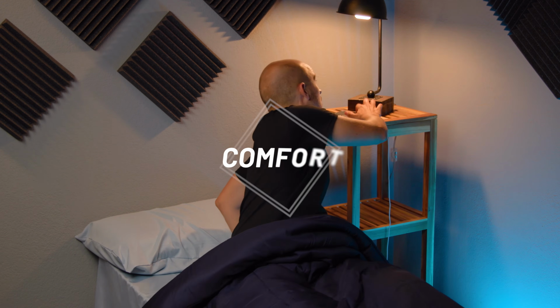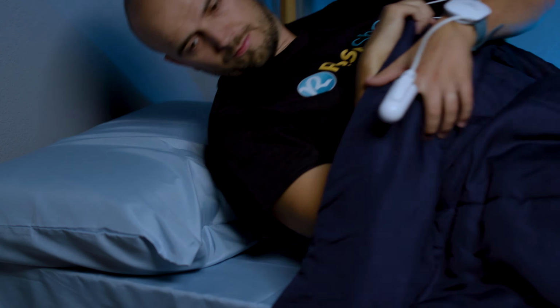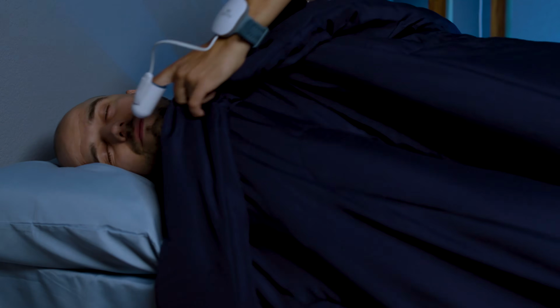For comfort, however, well, you just can't beat sleeping in your own bed, so an at-home sleep test wins here hands down. Lab tests are not done in hospital beds at least anymore, but places that look more like hotel rooms. But nothing beats sleeping in your own bed, and who wants to sleep knowing that someone is going to be up watching and analyzing them all night? It's a bit weird, huh? In addition, that extra data collection in the lab means more equipment attached to your body, including skull attachments to measure your brain activity. So all in all, an at-home sleep study is more comfortable for sure.